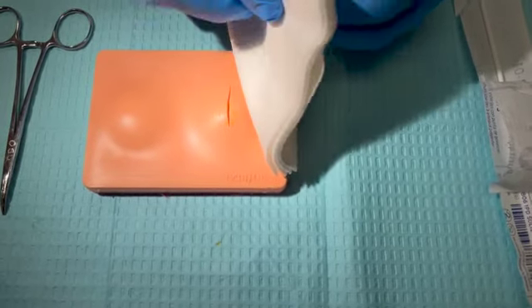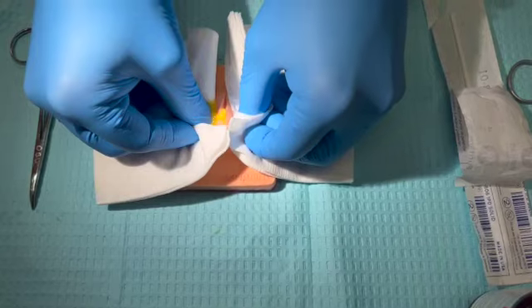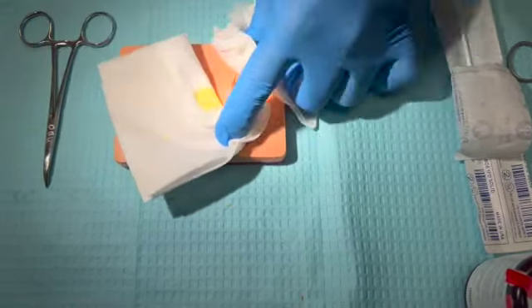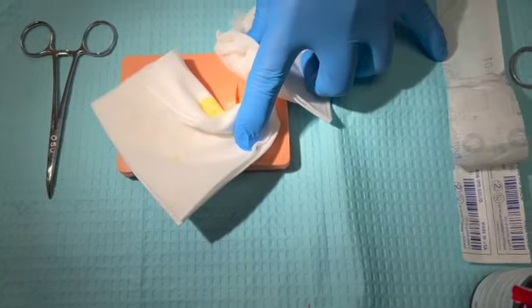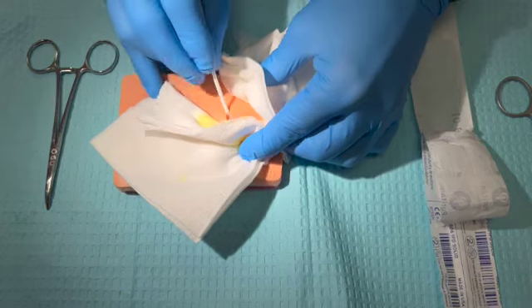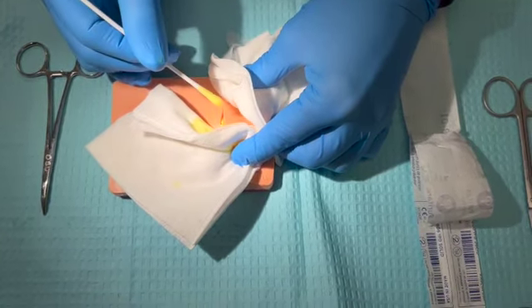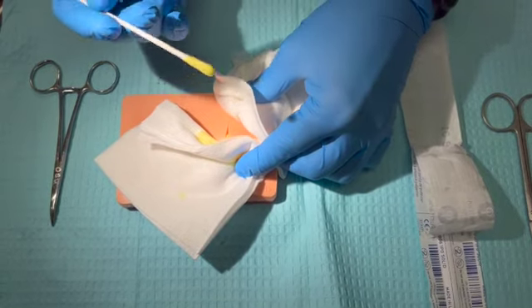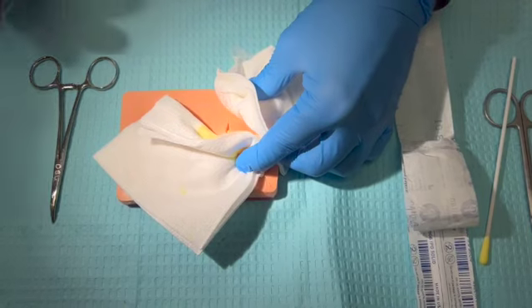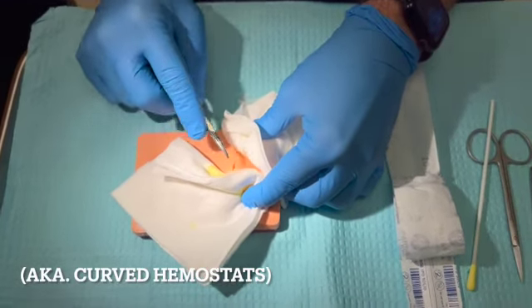I'm going to initiate drainage using the gauze. As I get the initial amount of drainage out, this is the point that I'm going to go ahead and obtain a culture of that material by getting in there really well and making sure that I am rotating that swab and that it is covered. I'll hand this to my assistant who will put it in the appropriate container so that it can be sent out. Now that that's performed, I'm going to utilize my curved forceps in order to probe the area.